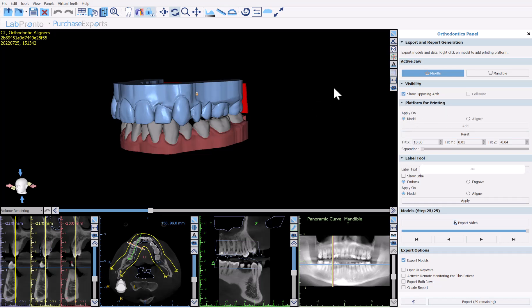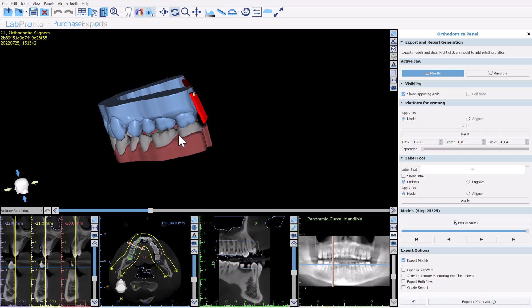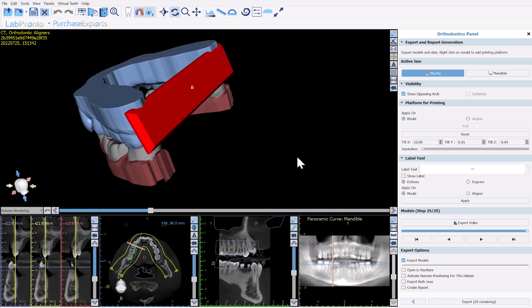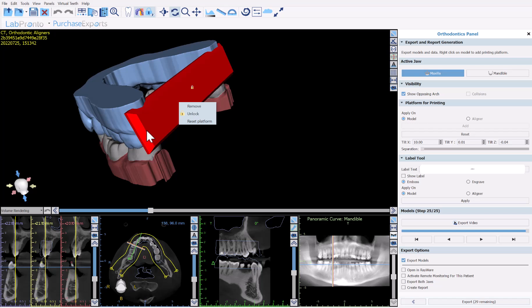Continuing down the panel, we have the platform for printing. If we right-click on the panel, we have options to remove it, unlock it, and reset the platform. The idea of this printing platform is that you can place the models vertically into the printer software and print them vertically.